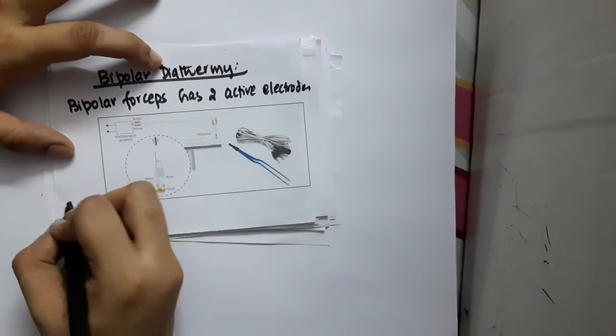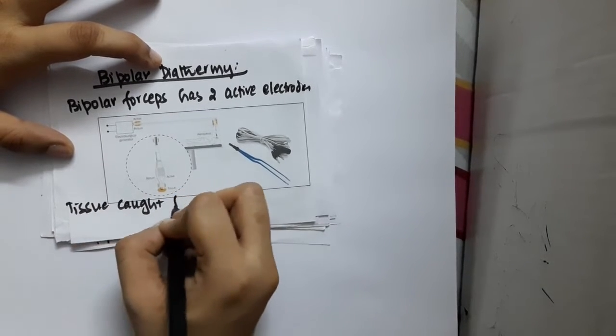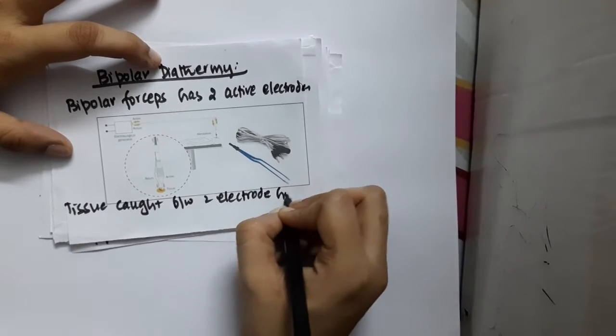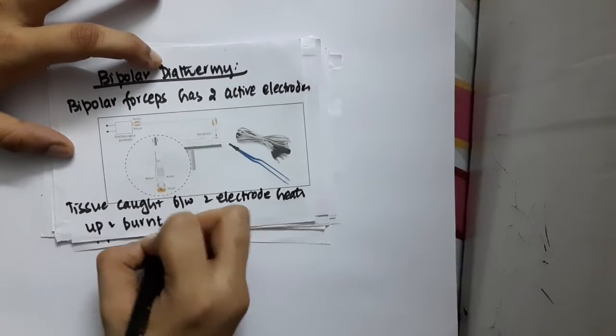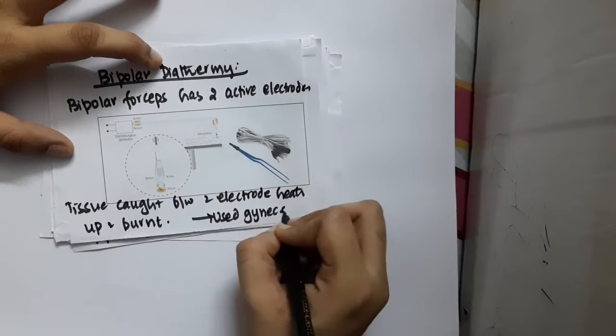And the tissue caught between two electrodes heats up and burns. Okay, so this is mainly used in gynecological procedures.